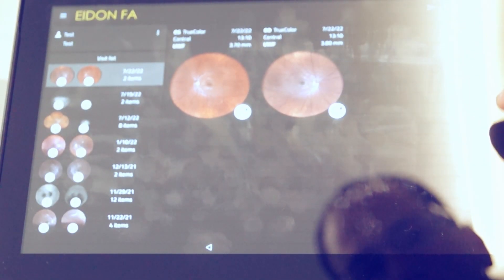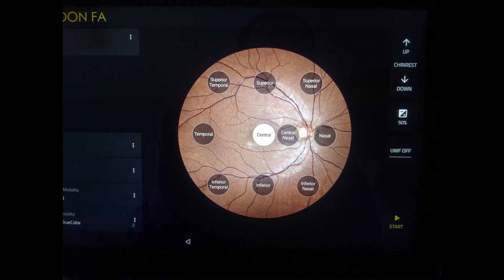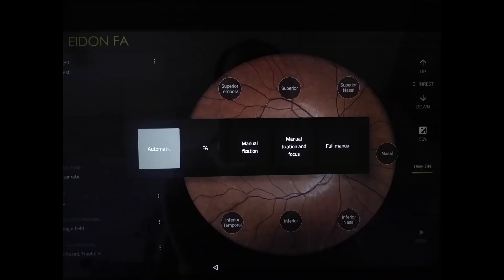After login, when you want to take a shot, this is the control panel. Here you can choose different fields — superior, inferior, temporal — and select multiple fields so the fixation target changes automatically inside. You can switch the ultra-wide field on or off. Capture modes include automatic, fluorescein angiography, manual fixation, manual fixation with focus, or full manual. You can also set laterality — right eye or left.